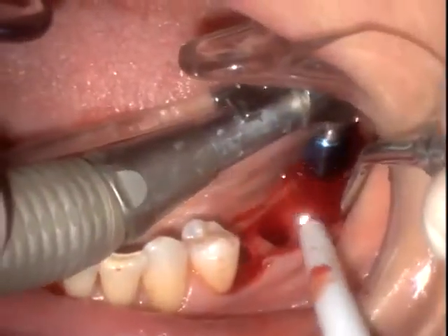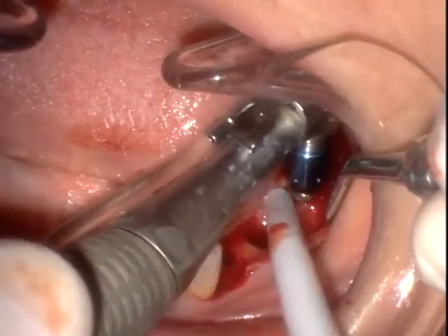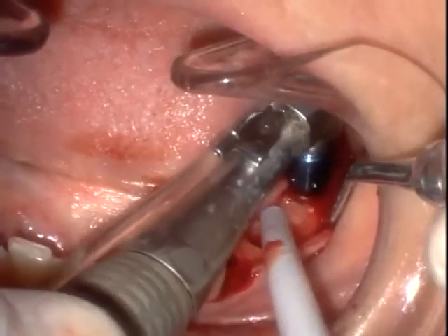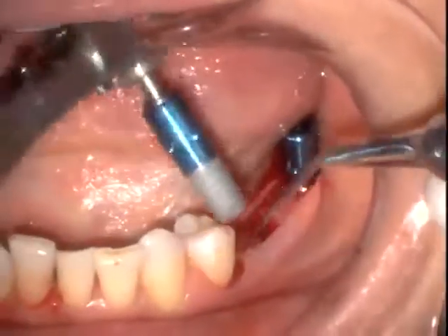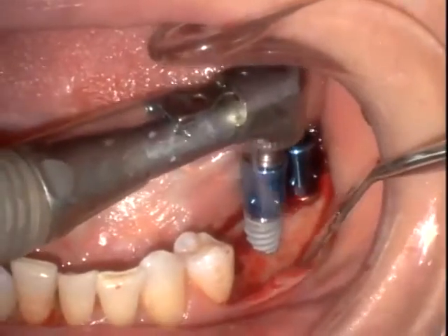So in the distalmost area, second molar, we're going to insert the 5 millimeter diameter, 8.5 length implant, making sure that we place the implant even with the crest of the bony ridge, exactly as we planned it on the cone beam image, and just above the mandibular nerve.